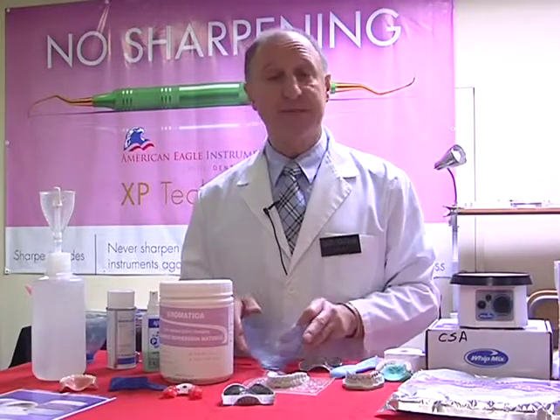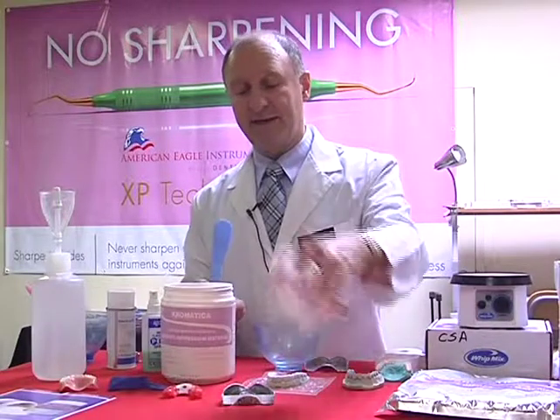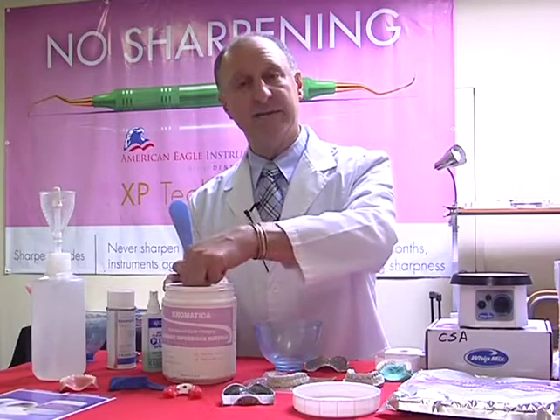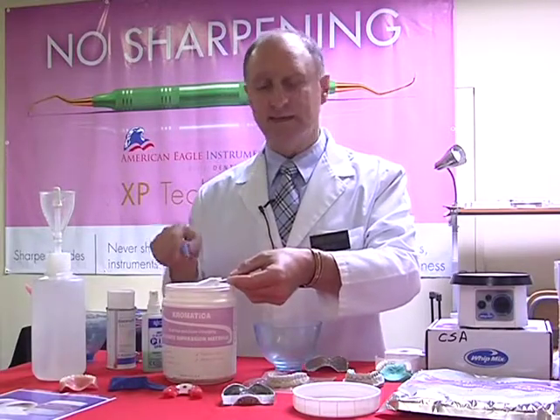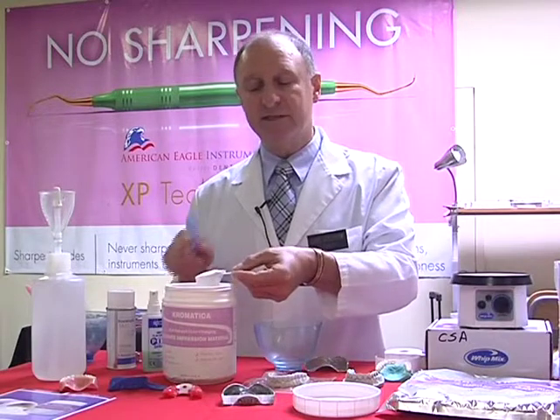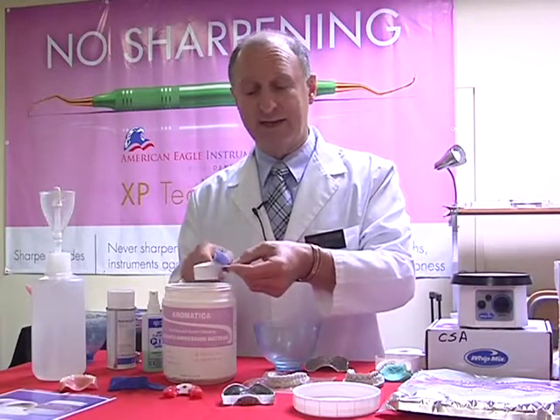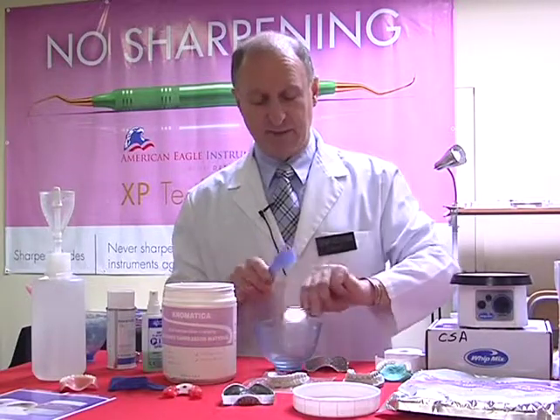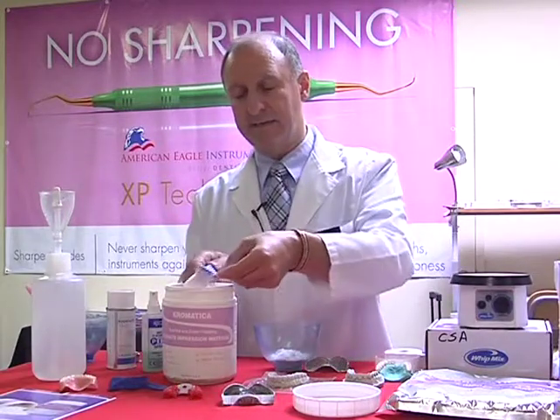So, I'm now ready to mix the alginate. So let's take hold of our spatula. And in this case, I'm going to take 2 scoops of the material, so packing the scoops tightly. Because I revolved or tumbled the canister 3 times, I don't need to tap on the surface of the scoop that's normally taught in most schools. I now slide off the amount, and I'm going to do this twice. Apply that into our bowl and do the same thing again.